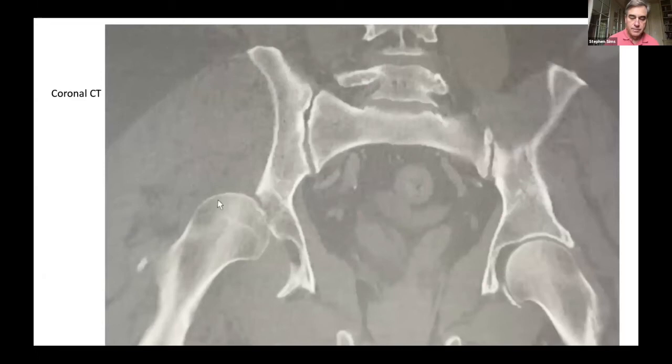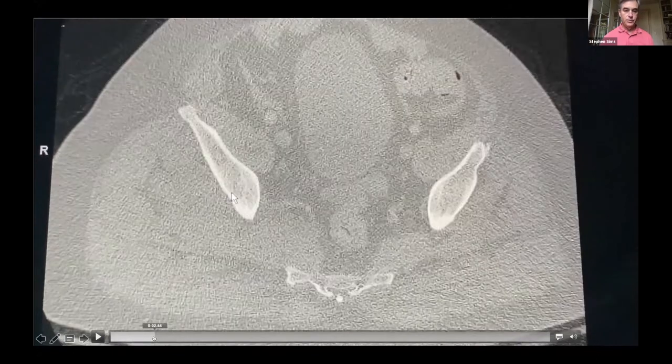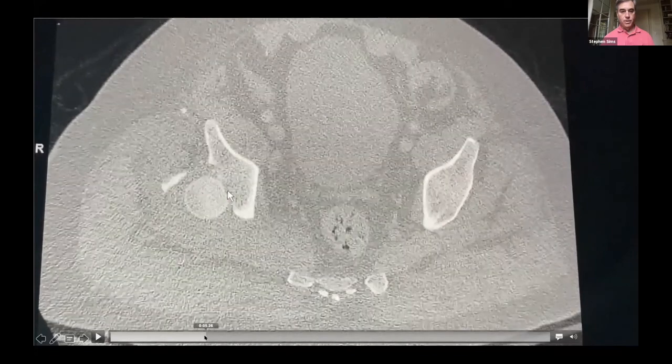This is just a single picture of his coronal CT scan, and I think it gives you the idea. You can see, again, what we were just looking at, if you can see my cursor here, how much of the actual roof is remaining, and the head has just fallen into where the acetabulum should have followed along like this, but there's nothing there to hold this in place. I'll show you the CT scans here because I think they're interesting to look at. I'll scroll through it.